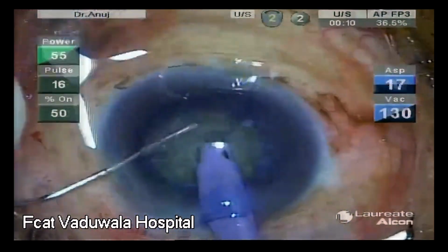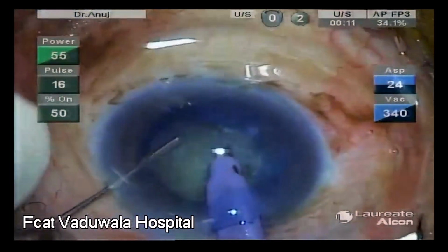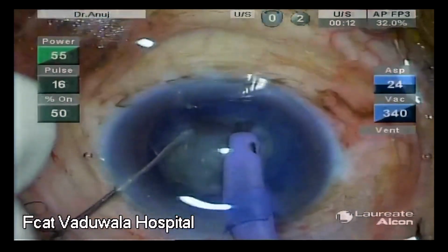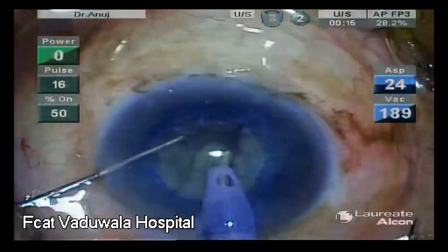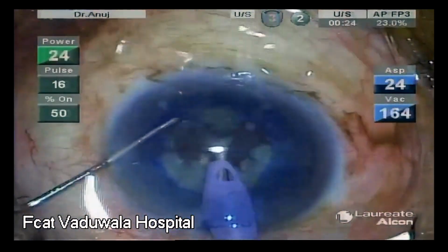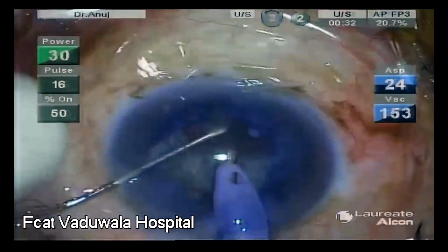The secret to a complete chop in every attempt is the correct depth and angle of approach. This is where the central well comes in the picture. The phaco tip should be anchored in the very center during the entire emulsification process, and the fragments are nudged towards the tip using the other instrument.